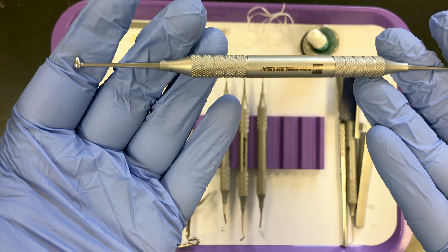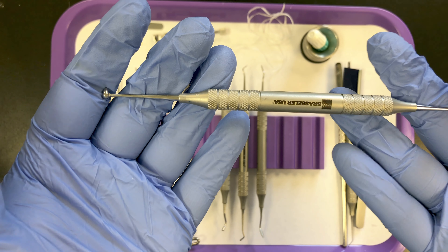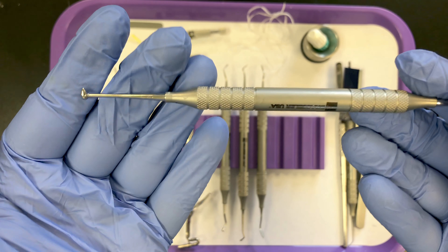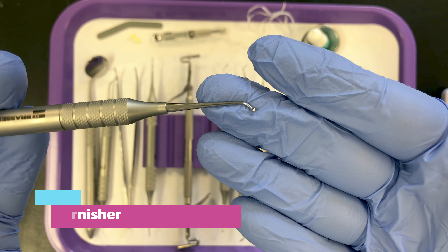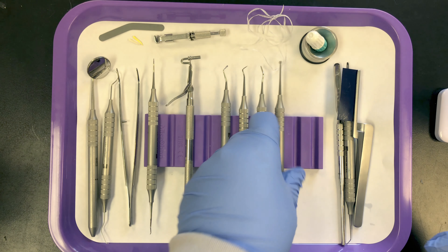After the filling is carved and the doctor has carved the anatomy back into the material, they need to polish it. We have a football ball burnisher here, and the burnisher will polish and smooth the material.